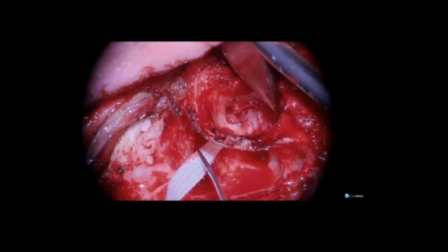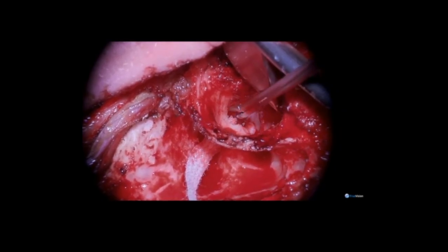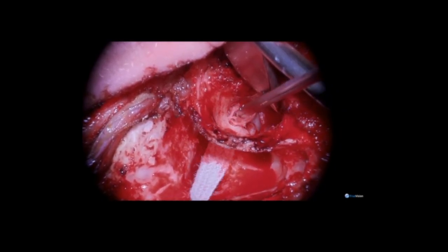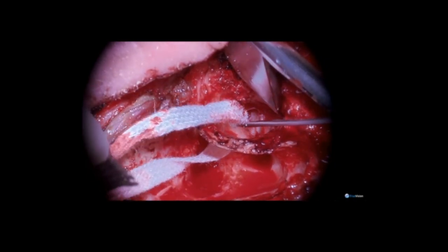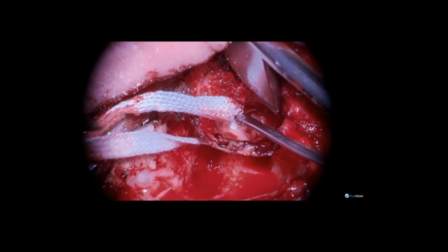I am introducing a small piece of umbilical tape gauze and scraping it along the medial canal wall edge to help ensure that there are no more cholesteatoma fragments remaining.